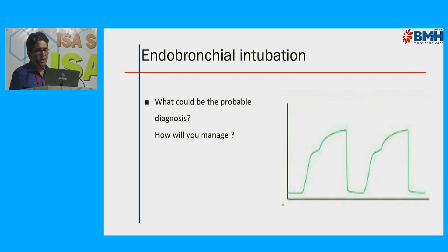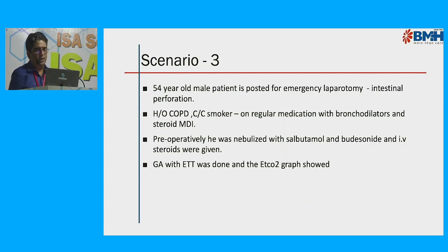Definitely it shows endobronchial intubation. You have to reassess the air entry and recheck the tube. Okay.